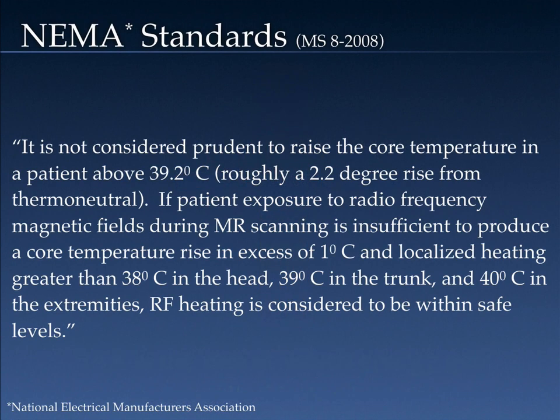The NEMA standards state the following. It's not considered prudent to raise the core temperature in a patient above 39.2 degrees Celsius, roughly a 2.2 degree rise from thermoneutral.